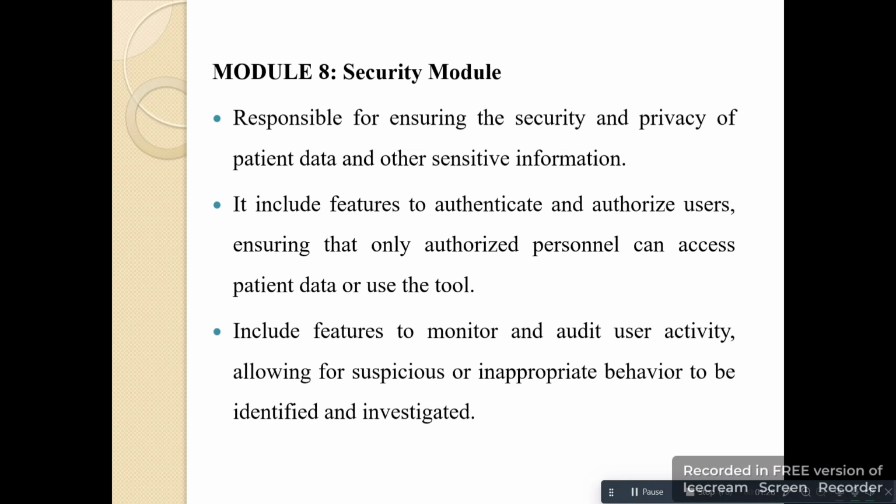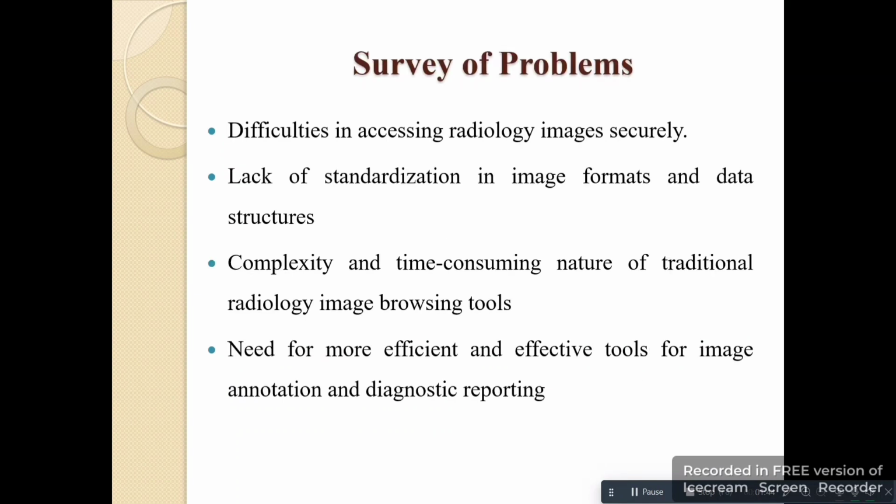It includes features to authenticate and authorize users, ensuring that only authorized personnel can access patient data or use the tool. It includes features to monitor and audit user activity, allowing suspicious or inappropriate behavior to be identified and investigated. Survey of problems.